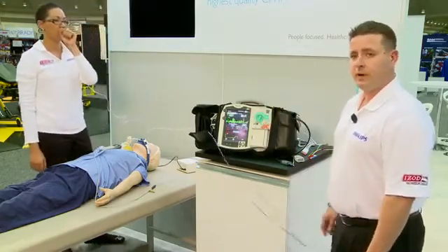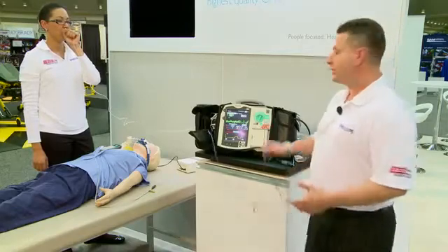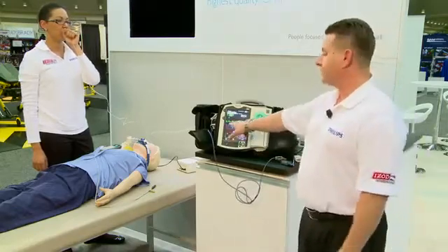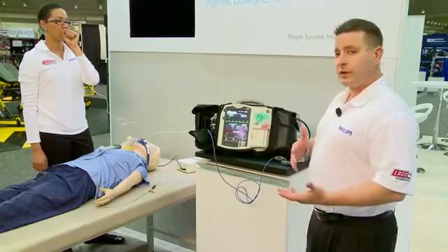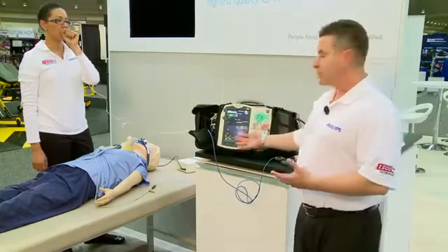We can deliver this in a time frame of less than four seconds. And by doing this, what we know is when we see patients come back to spontaneous circulation return, we're able to change the level of care we give by now having a monitor that keeps pace with us.